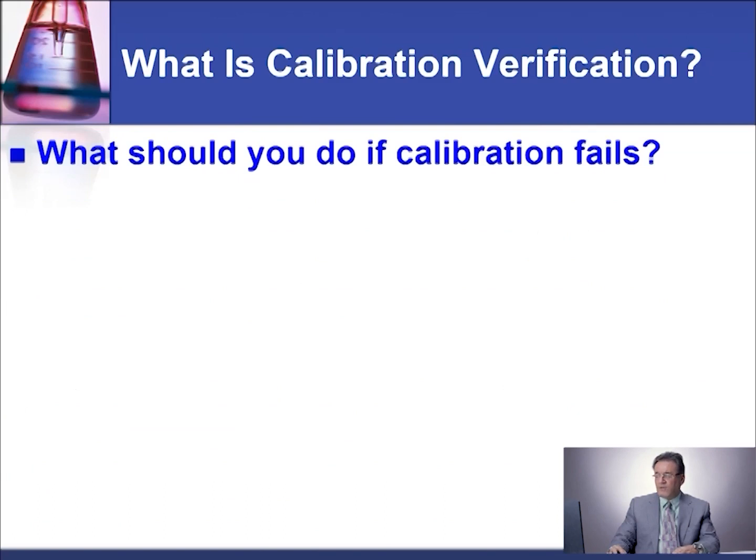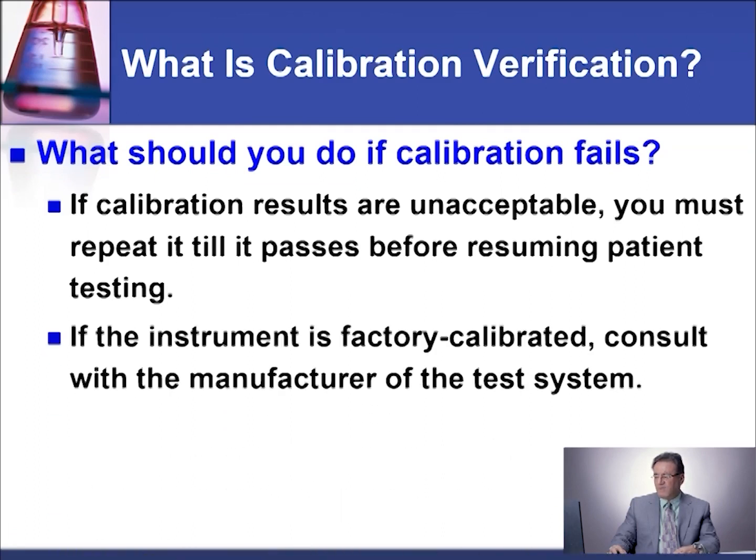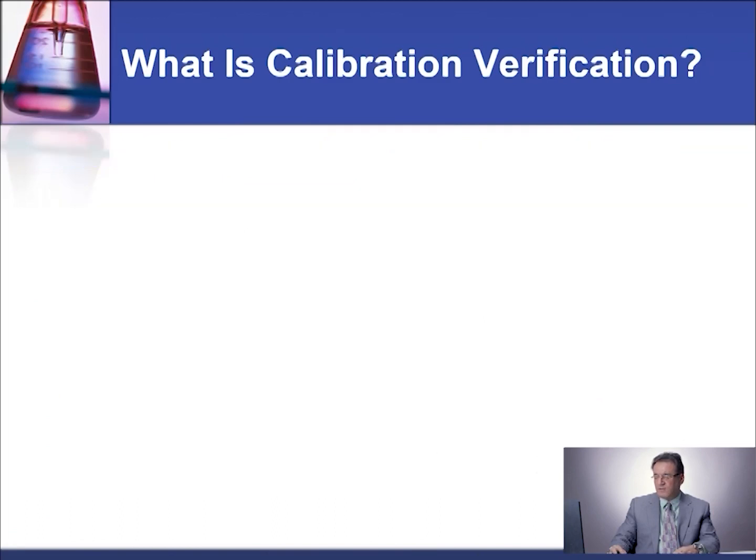What should you do if your calibration fails? Basically, obviously, you need to repeat it. If your calibration fails, just repeat it. If the instrument is factory calibrated, consult with the manufacturer of the test system.